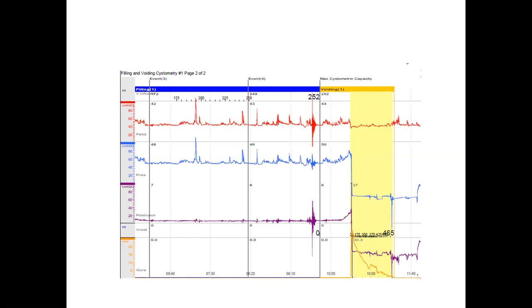It's also interestingly the point at which the flow starts, indicating that maybe the catheter size you used was too large and forming a slight obstruction, making it difficult for this patient to void past. You've identified the issue: the vesical line has fallen out.